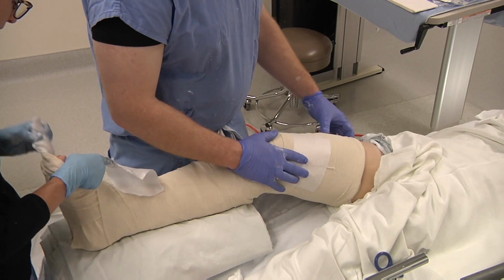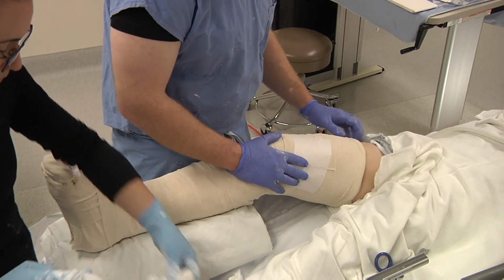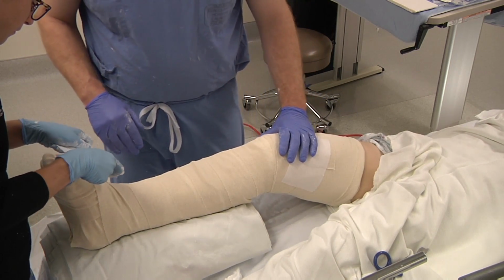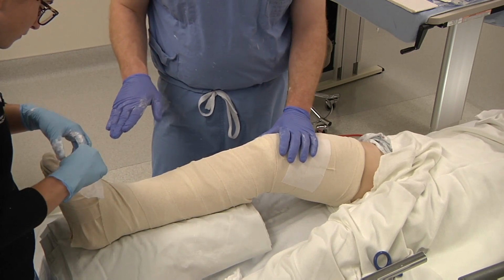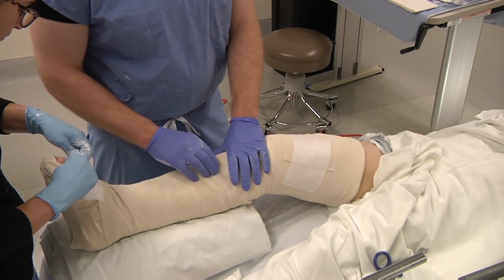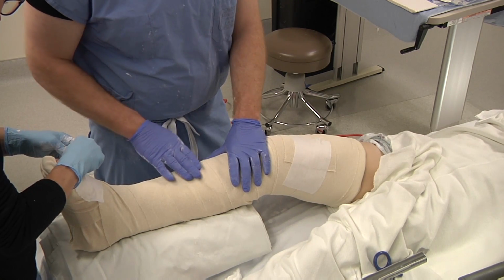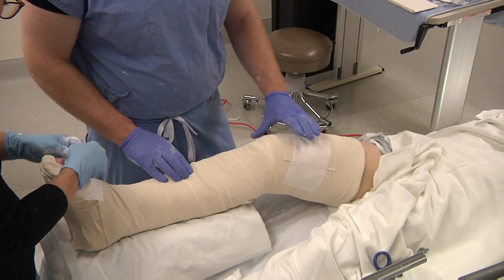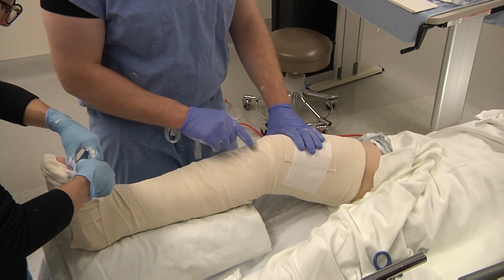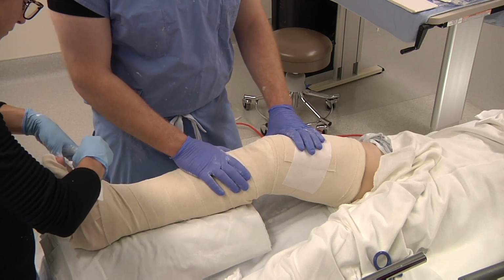Thighs can swell even more. And if there's any plaster, it can really cause some damage, ulceration, skin issues. Make sure that you can see all the toes so that you can perform a neurovascular exam. Usually in this case, it's also very important to create some windows for which you can do compartment checks, as this is usually done for higher risk injuries, including tib-fib fractures, segmental tib-fib fractures, open fractures, tibial plateau type injuries.